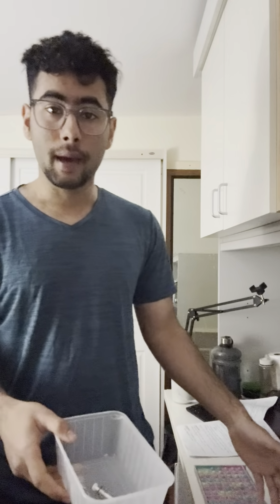This is a 25 gauge needle, and always make sure that you are checking the dates and how much dose you are giving, checking randomly, like taking out from the bucket. So I'm doing the first check. I already told her that I will be back in the room. Then I'm in my medication room doing my first check with myself.